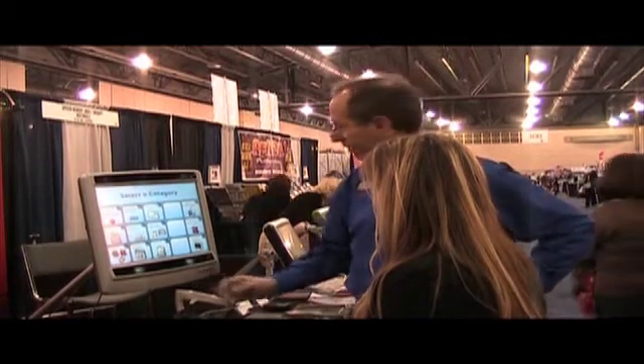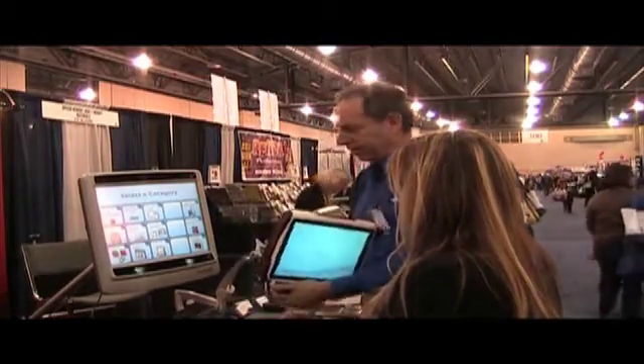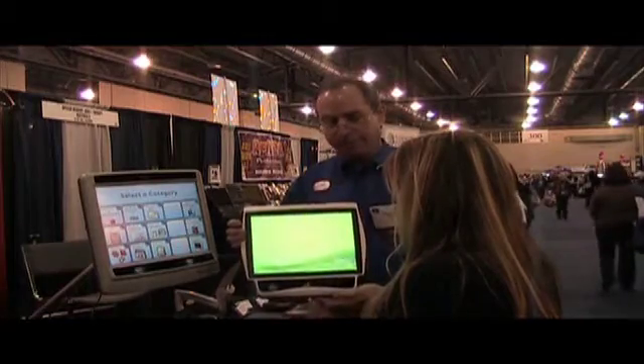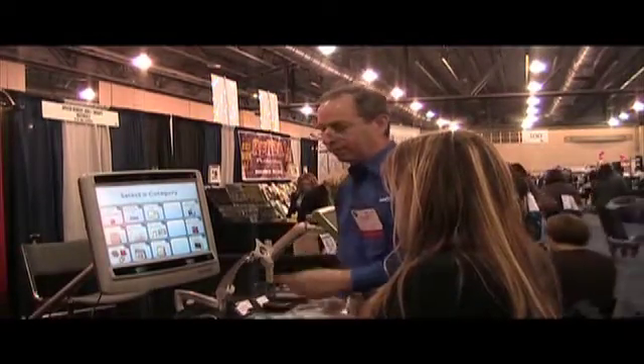And this is my Tobii P10. We have another product called the C12 with CI. And they both do eye tracking. So we're going to try the Tobii P10 first.